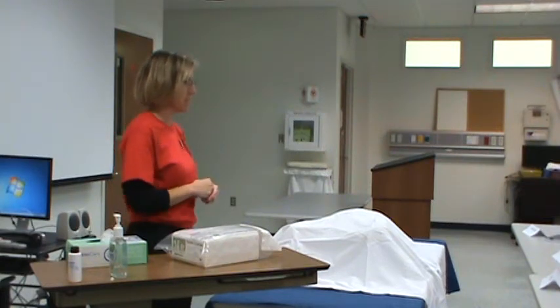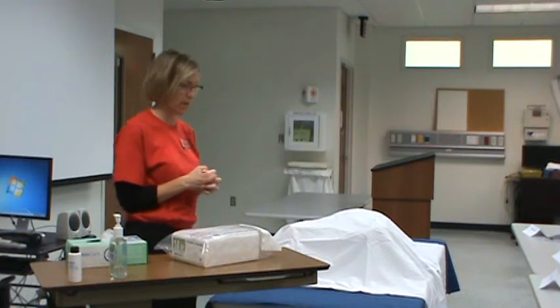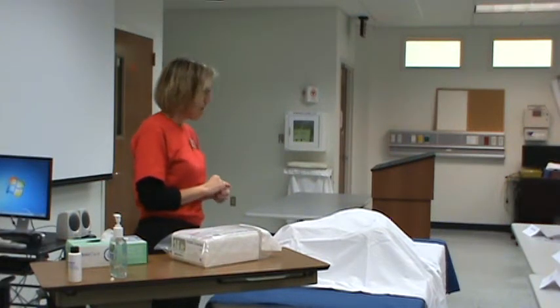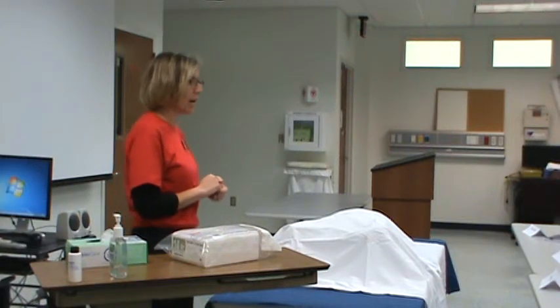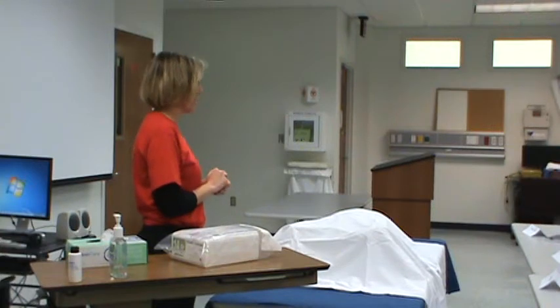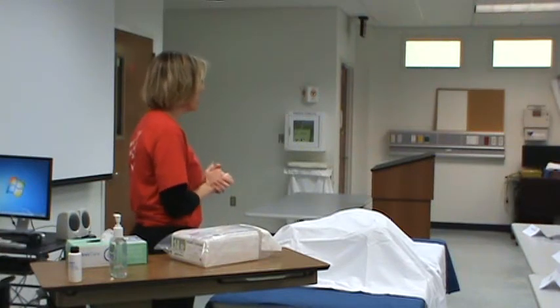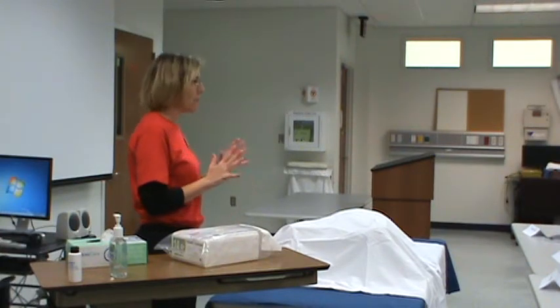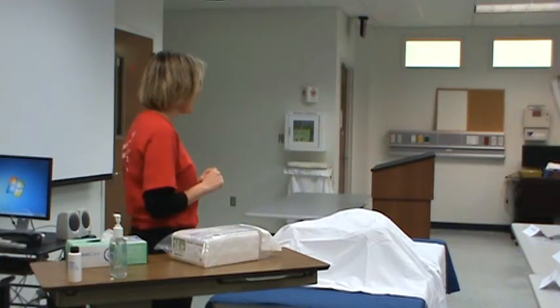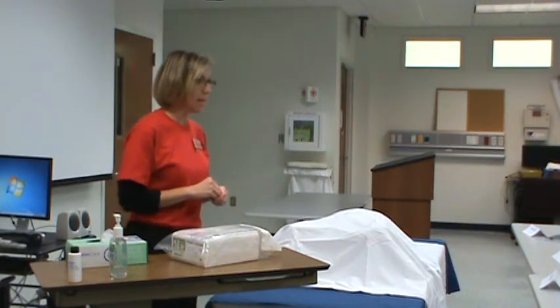And this Mrs. Smith says, no, I have no allergies to anything. Okay, Mrs. Smith, I'm going to place a Foley catheter. You may ask if she's had one before. Maybe she has or maybe she hasn't. And Mrs. Smith says, no, I've never had one before and I'm really nervous. And you say, well, it's okay, Mrs. Smith. I'm going to let you know everything that I'm doing. It's going to take me a few minutes to set up, and then I won't do anything without letting you know what I'm going to do.